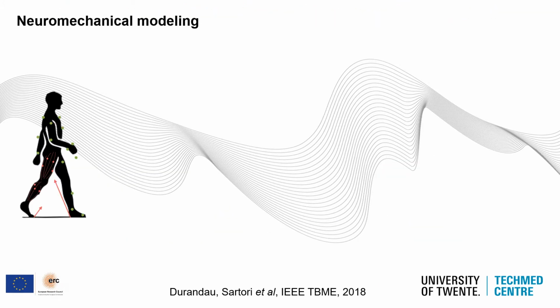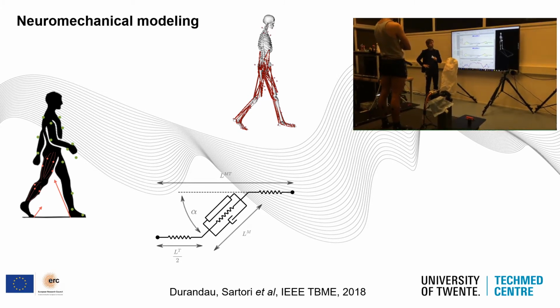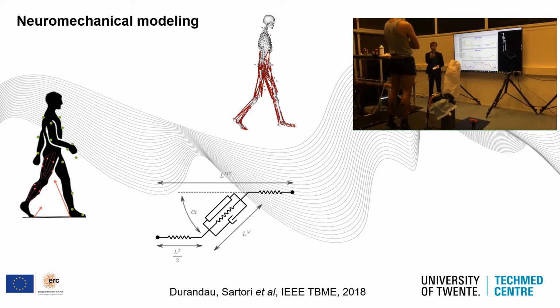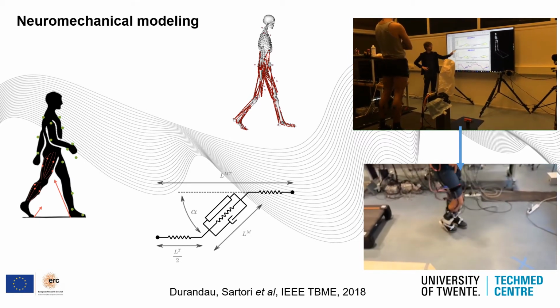One of the solutions to this goal is the use of real-time neuromusculoskeletal modeling, which enables creating virtual twins of an individual person. This model contains a numerical representation of the musculoskeletal system, but also incorporates formulations to infer how the nervous system controls the neuromusculoskeletal system. The model can be personalized to a patient to reflect their residual muscular capacity by being informed directly by experimentally recorded EMG and joint angle. This allows computing muscle and joint torque that can then be used to enable voluntary control of an exoskeleton.